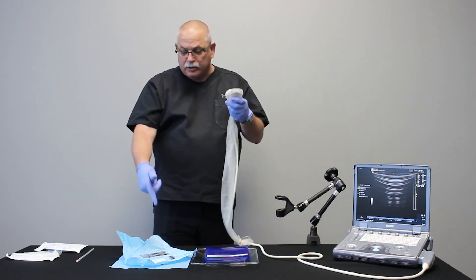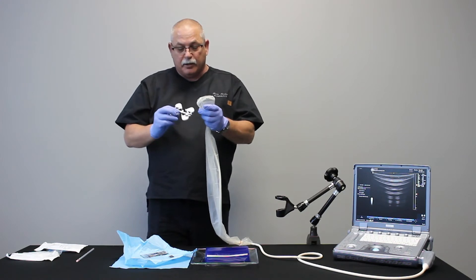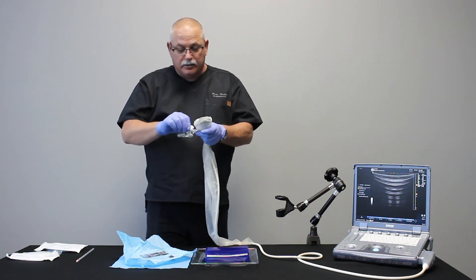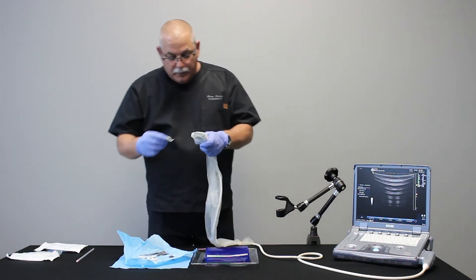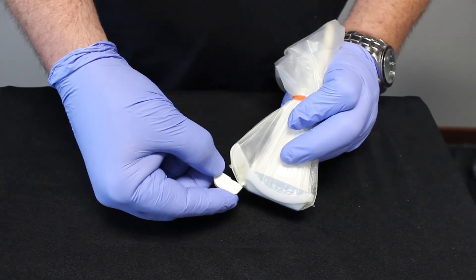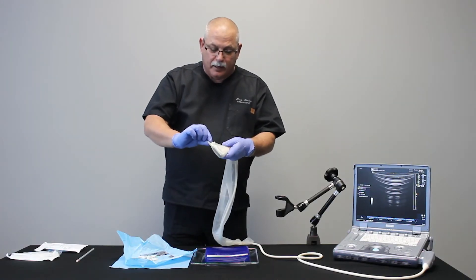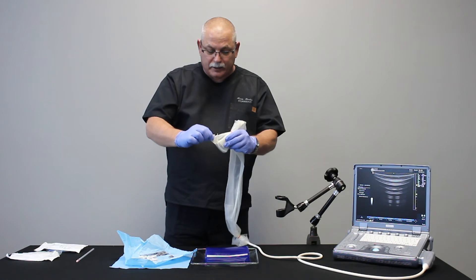Then I'll choose the appropriate size guide for what I'm doing today. I'm going to use an 18 gauge device, so I just twist that off — this fits only one way. The rounded part fits in the bottom and this will click onto the top. Once it's on, it's secure and firm.